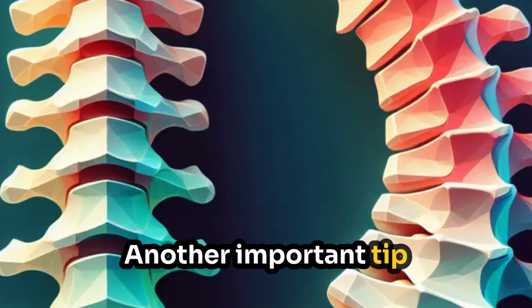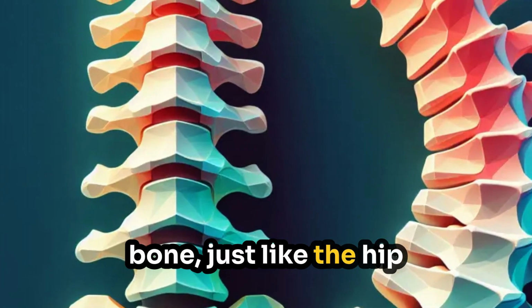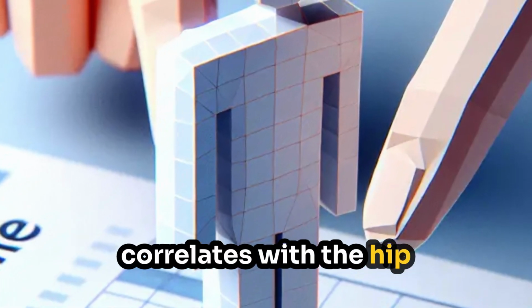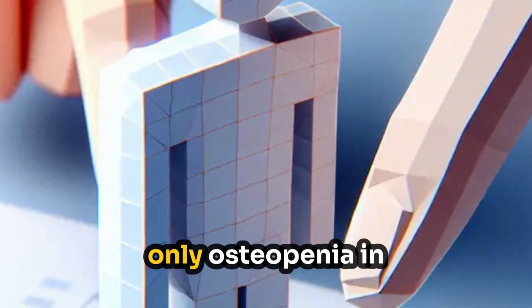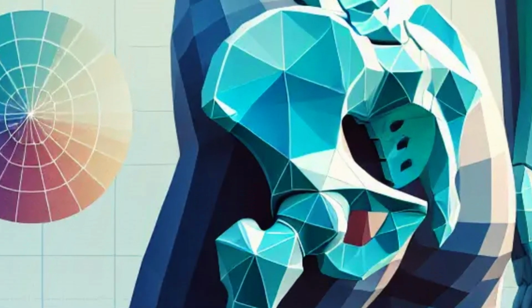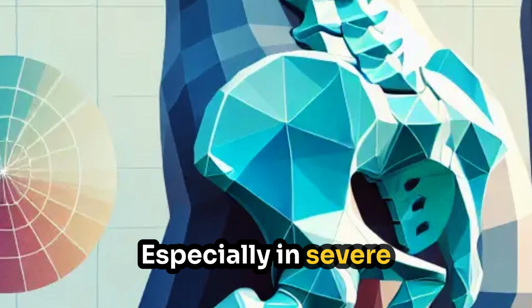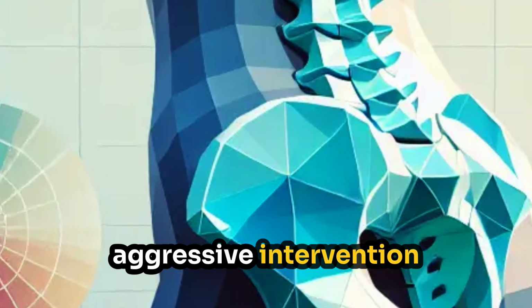Another important tip: the forearm is made up mostly of cortical bone, just like the hip. So forearm bone density often correlates with the hip. If a patient has severe osteoporosis in the forearm, but only osteopenia in the hip, treatment may still be needed. In other words, don't ignore the forearm. Especially in severe osteoporosis cases, the forearm can reveal a need for aggressive intervention.